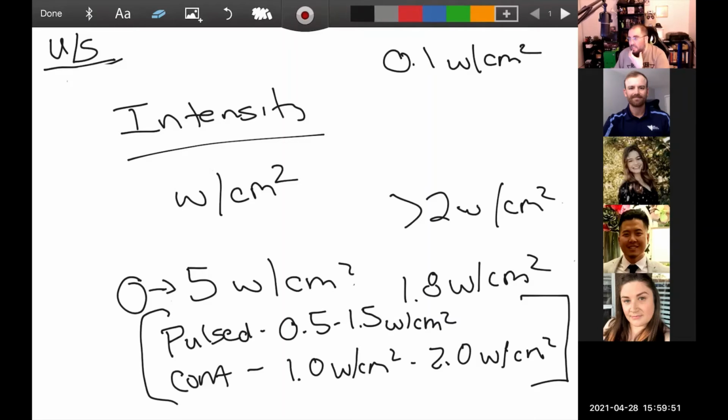If you get a question, like if we were doing still the practicals, it's one of my favorite questions to ask you guys is, well, what intensity are you going to pick? And somebody usually says 0.5 to 1.5 watts per centimeter squared. That's not an intensity. I want you to say, I'm going to pick 0.7. Great, do it. Right? If you'd say 1.5, well, why did you pick that? Well, they've got a little bit more tissue in this area, so I'm going to want to deliver a little bit more energy, and it's a larger area.